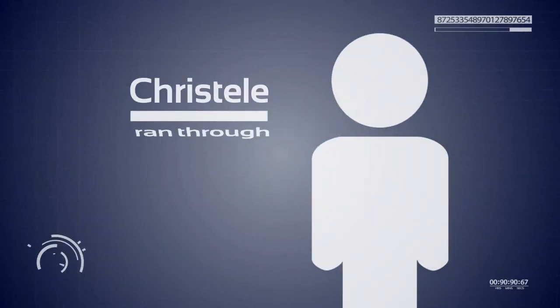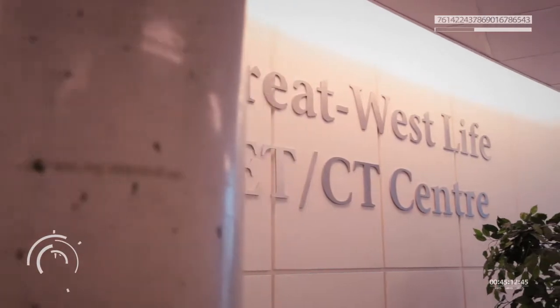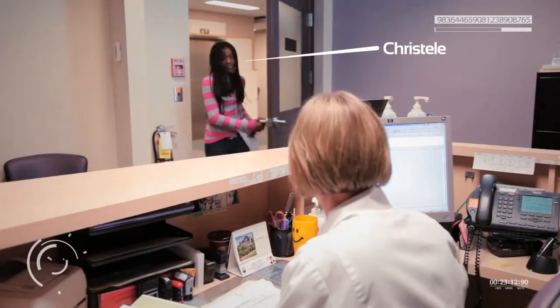Christelle has volunteered to run through a scan procedure to show us how it works. Hello, I'm Christelle. They won't actually run the machine on me since it involves radiation, but I'll get to see what it's all about.